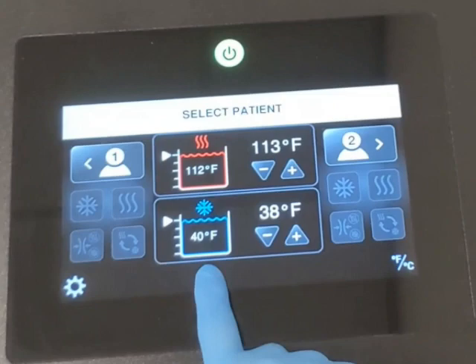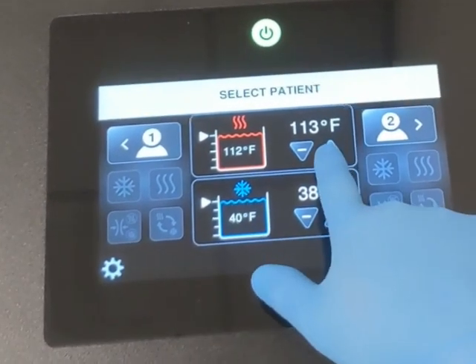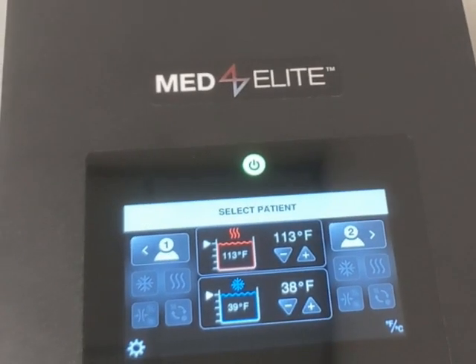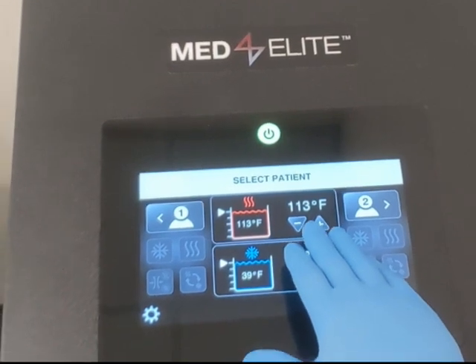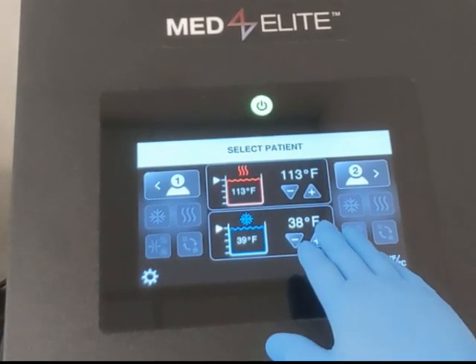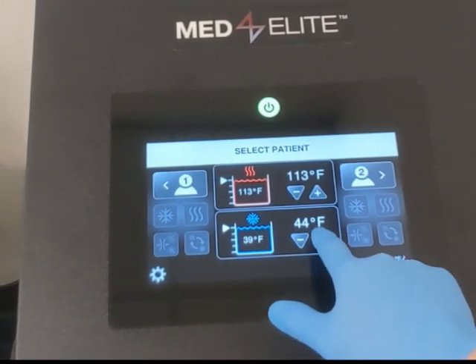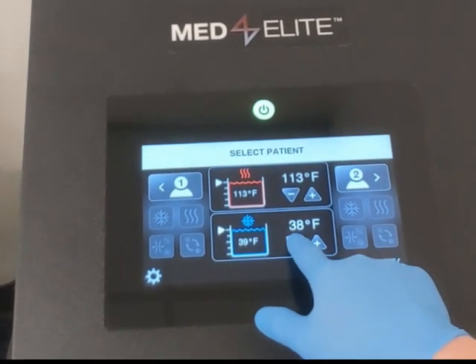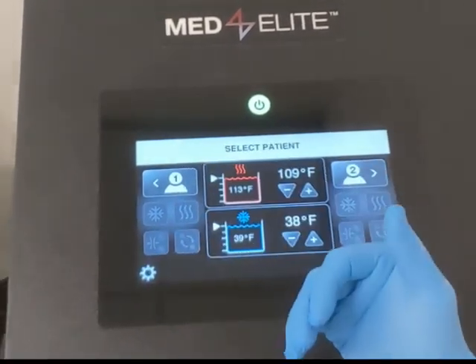This is the active mixture — what it's currently reading. This is what it's currently set at. By default it should always be automatically set to 113°F for heat and 38°F for cool — since we're Americans. Notice it can go up; I can raise the cool temperature, but 38 is as low as it goes. Vice versa, we could bring the heat down and crank it up.